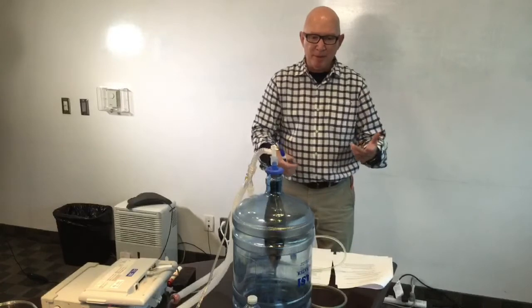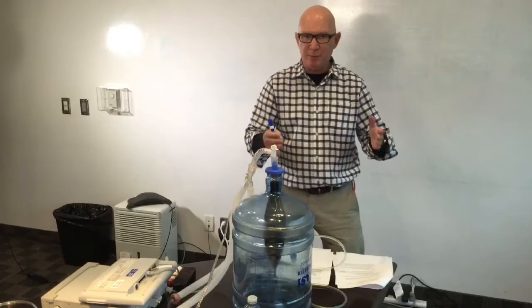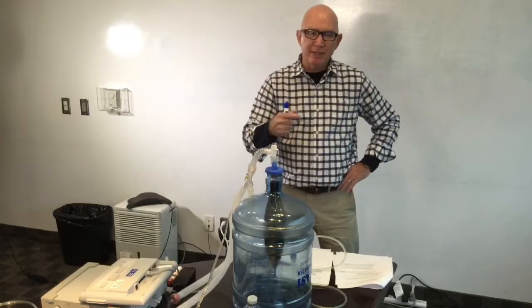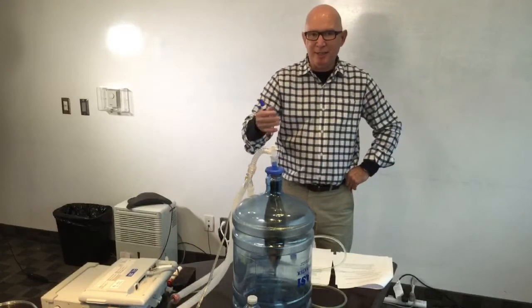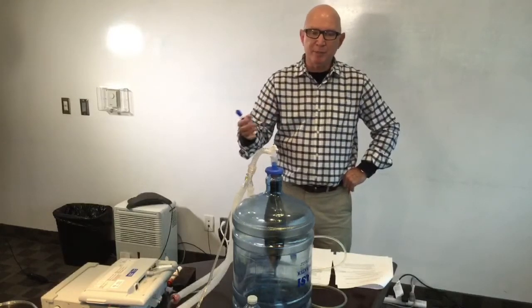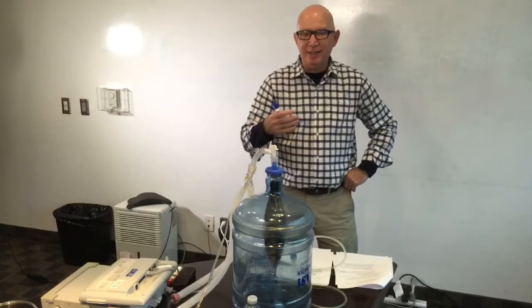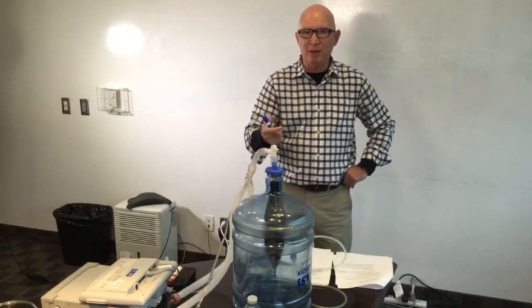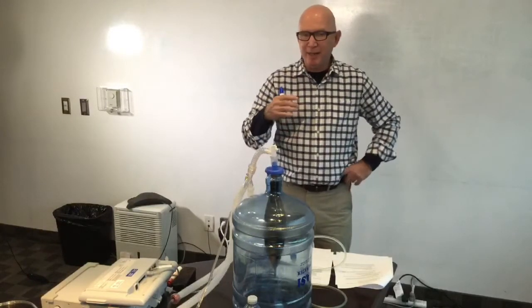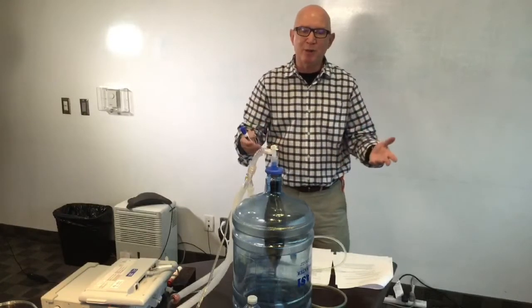is that when we talk about mechanical ventilation and transport, we might think that we have these patients for a brief period of time. And since the ARDSNet trials in 2000 and the evidence that came out of that, we recognize quite well, and everybody accepts, that whether it's short-term or long-term ventilation, large tidal volumes can cause injury to the lung. And so for the last 17 years, we've been using 6 to 8 mL per kilogram ideal body weight tidal volumes. That has worked well for us, and in the context of transport, we use the same volumes as well.